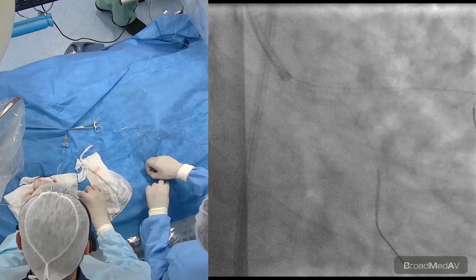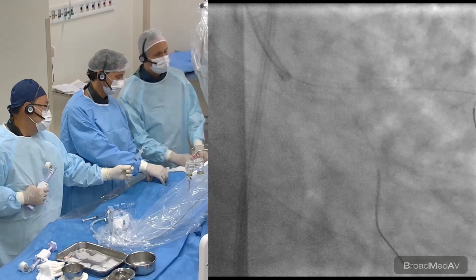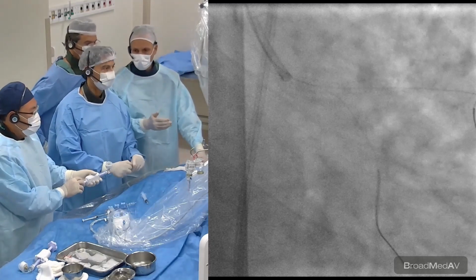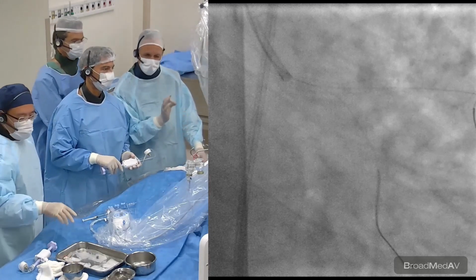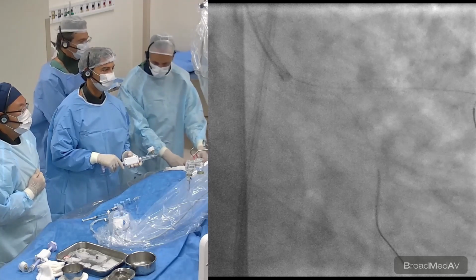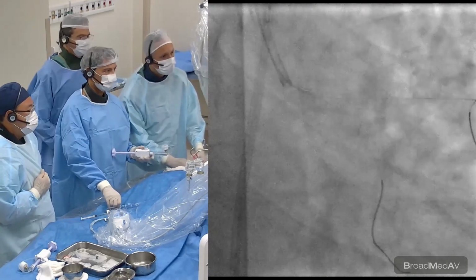Can you have the image from the operators, please, now, not the hands? And when we do that, we are apposing the struts to the proximal diameter, to this proximal geometry. It's fitting much better. The balloon has to be positioned exactly at the distal end of the carina, where the flow divider is. And with that, we can also create, if you are in the right position, some scaffolding to the ostium of the side branch. This is a provisional strategy because we did not see much disease in the ostial circumflex. Is that correct? Exactly.